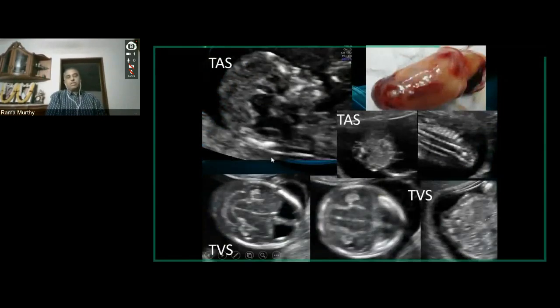And in the same case, you begin to see the spine, there is a spina bifida, and also intracranial signs. You have the thalami, the peduncles, right? So the thalamo-peduncular view, you had to have the cerebral peduncles much narrower than the thalamus, but here it is not. It's almost the same. So this is called the parallel pedicle sign or parallel peduncular sign, and a very great sign to tell us that there is something happening down the spine.